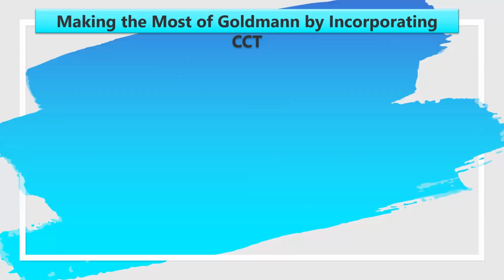So how can we make the most of our Goldmann tonometer? By incorporating the central corneal thickness in our patient. Now this is almost my final slide: what precautions should we take in patients in whom we are going to measure the central corneal thickness, so that whenever we incorporate it into the Goldmann reading, we get an accurate idea of intraocular pressure.